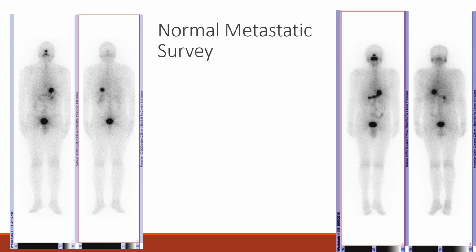Anytime you see activity around the thyroid bed, in the chest, sometimes patients will have that substernal or sublingual thyroid tissue that's remnant. And remember, thyroid tissue is a bed, not a solid gland. So that's kind of normal for that to be expected.